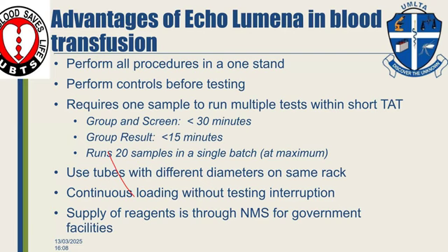Two, it emphasizes running controls before testing. Without controls passing, the machine doesn't allow you to run the test. And that assures us of the quality they were emphasizing.